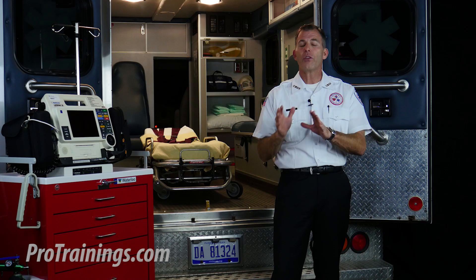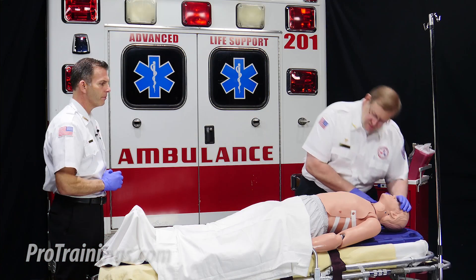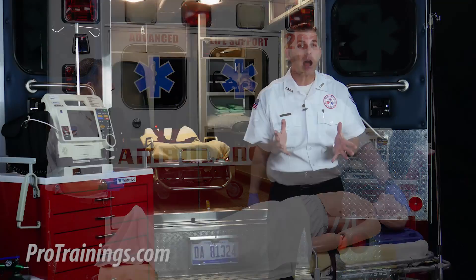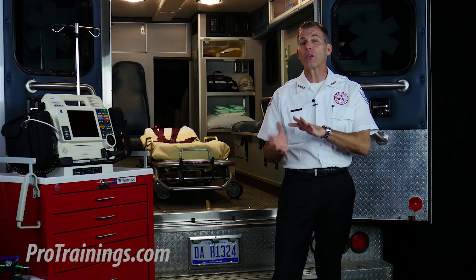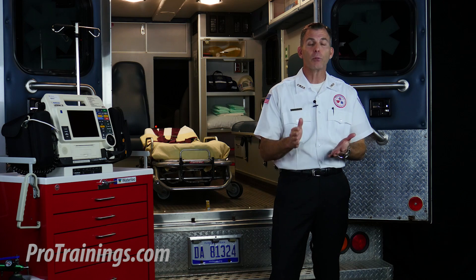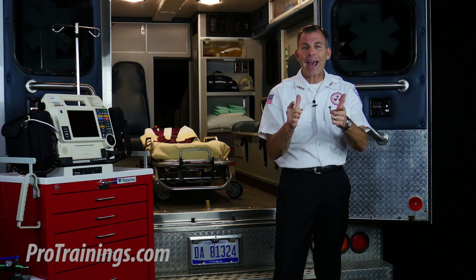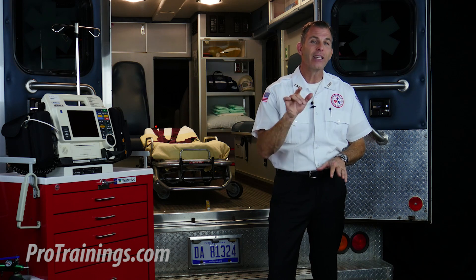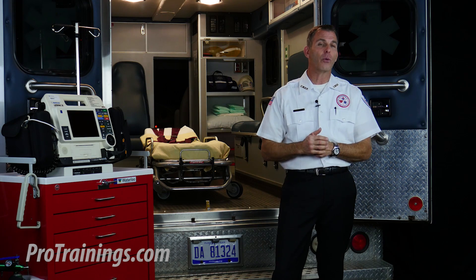Now we want to assess for a carotid pulse as we begin gathering appropriate equipment that may already be in the room. As we check for a carotid pulse and breathing, we find no pulse and the patient is not breathing. It's at this time that we want to place a CPR board under the patient or, if they're on a hospital bed with a CPR button, activate it so that the bed will deflate and make the surface rigid.